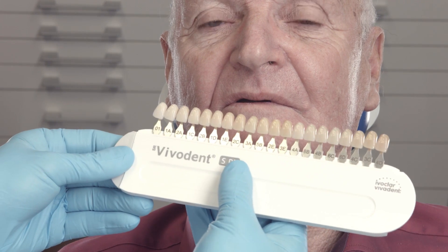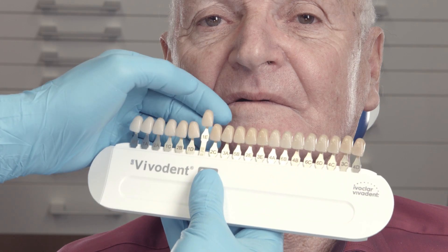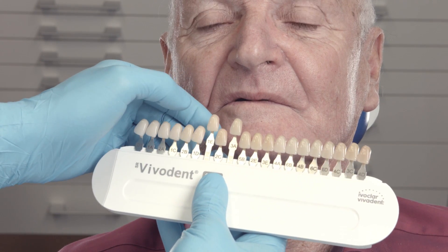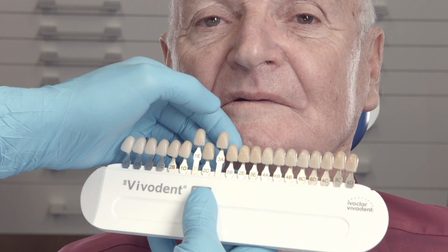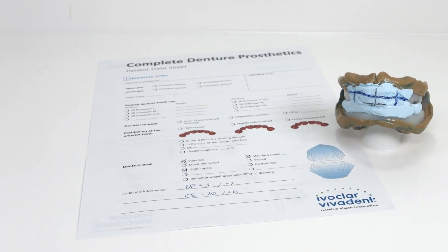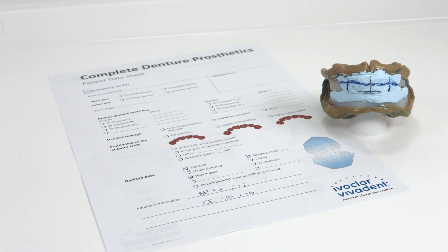Together with the patient, you can now select the desired tooth shape and shade. It is also important to find out from the patient if they would like the anterior teeth to have a straight, natural, or individualized position. Subsequently, send all the information you have collected to the dental laboratory.